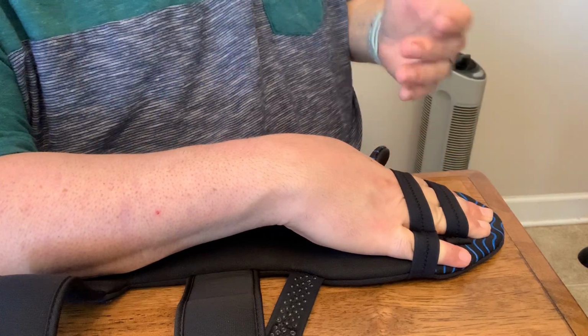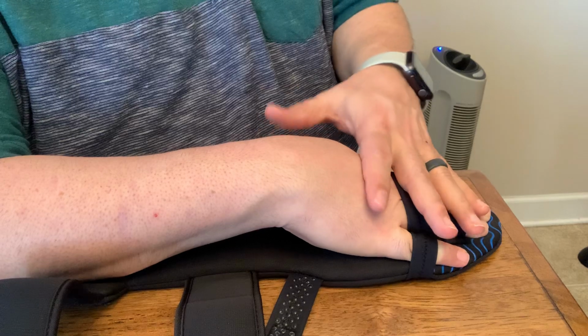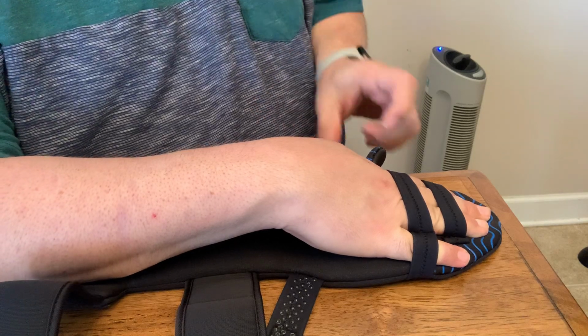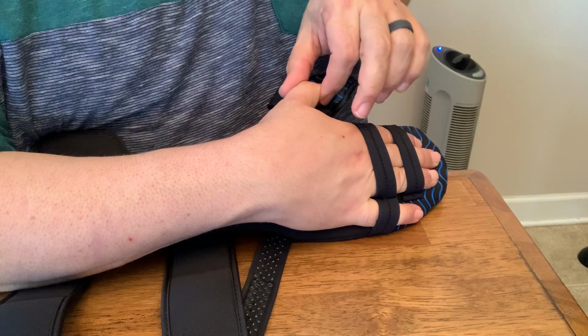So now my hand doesn't want to curl. It's strapped down. It doesn't fight me as much if I just relax. Just right like that. It's almost like a mental thing, okay? Now see how my thumb wants to curl. I don't know if you can see that. See how my thumb wants to curl. So you just straighten the thumb out.